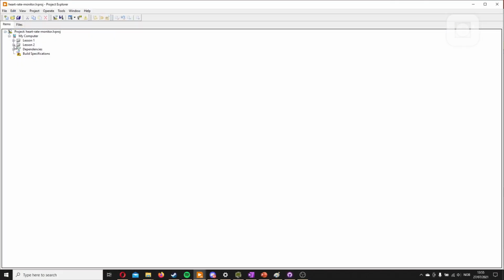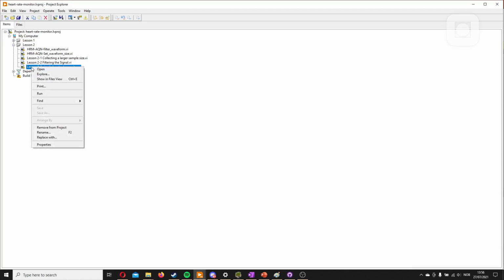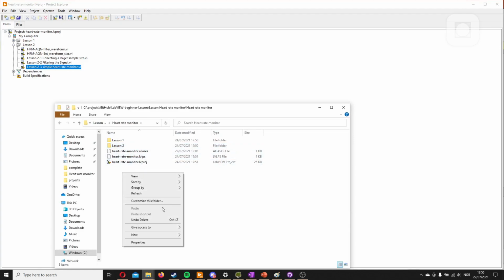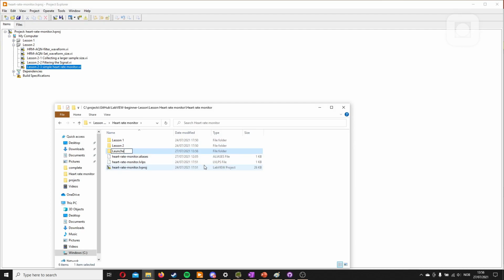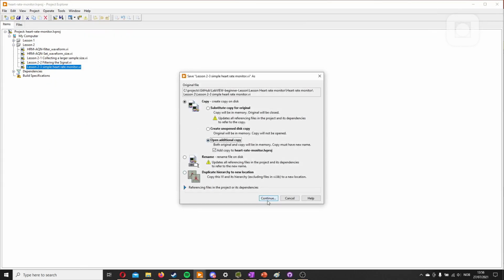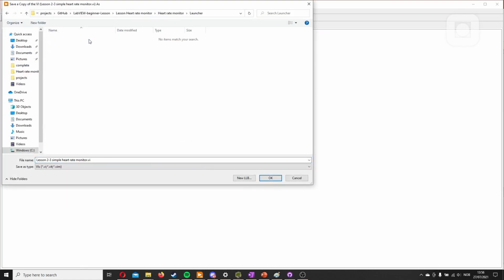We'll start by setting up the folder system properly from the start, and now we'll not base it on lesson, but rather functionality. So we'll just explore here, so you get to the right place, and here we're lesson 1, 2, but now instead we want to make a folder called launcher, because the main application launches the application. So we'll copy this because this is what we'll base it on. And here we'll call it lesson 3 because we'll use it for the whole lesson. And we can just call it launcher.